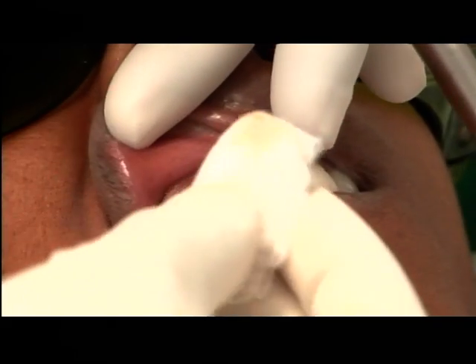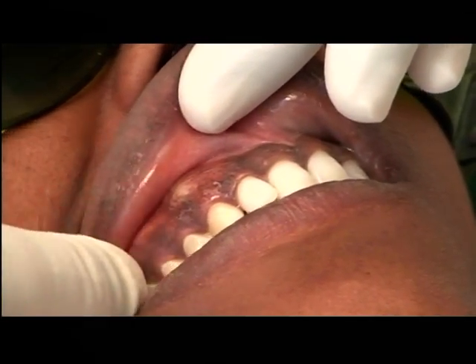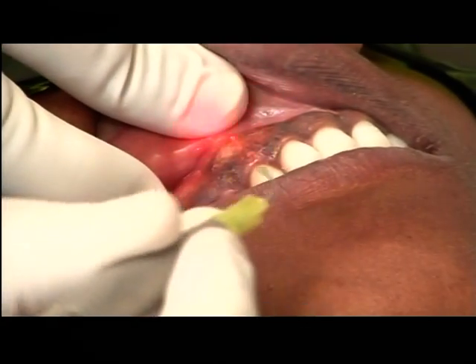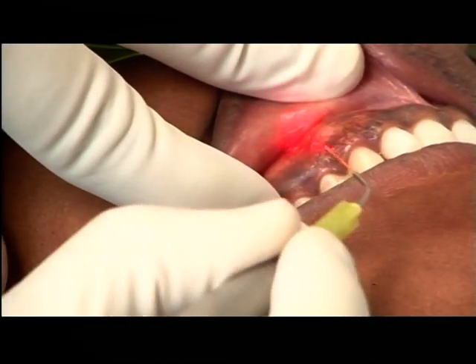The precision is much better because you're using a mineral fiber. I would have preferred to use a 400, but 320 is also fine. Can you see this area? I've just wiped it. Yes, sir — you can see the epithelium is removed from that area.